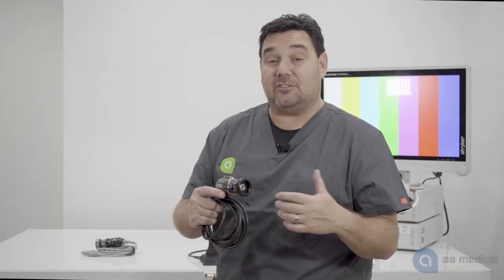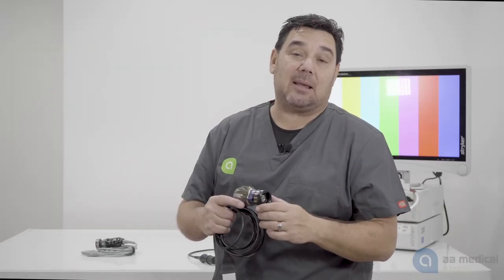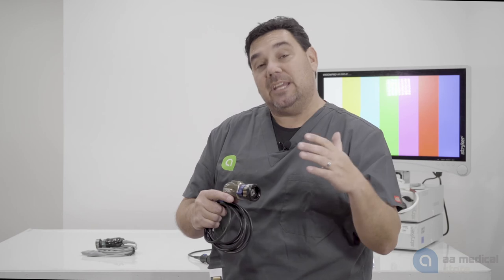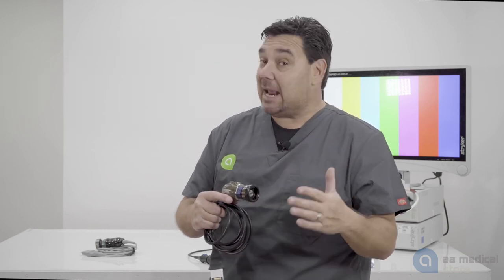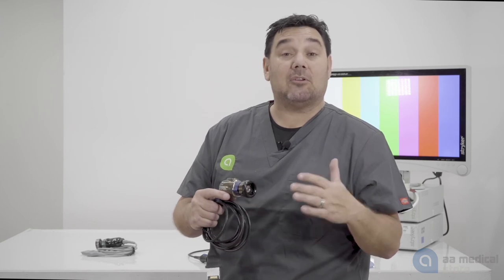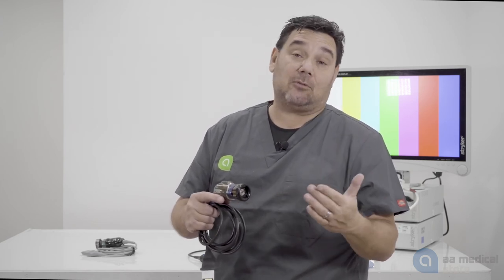In that case you would only be able to use eyepiece arthroscopes. So you need to know what type of video system you have, what type of camera system you have, and whether or not it can take a direct-mounted or C-mounted arthroscope.